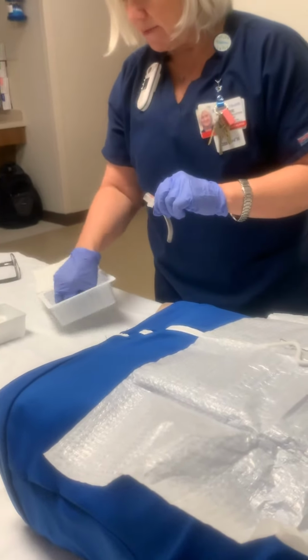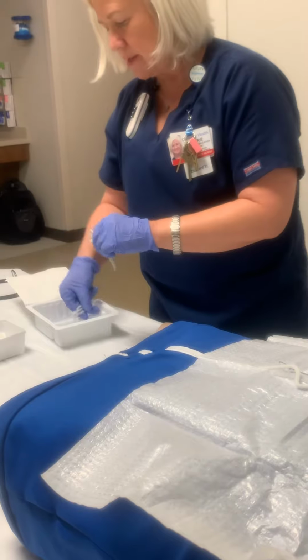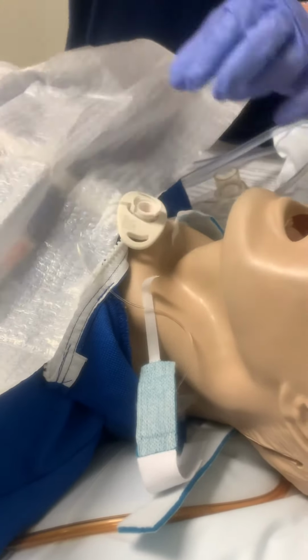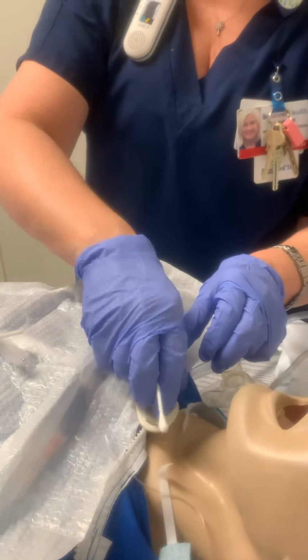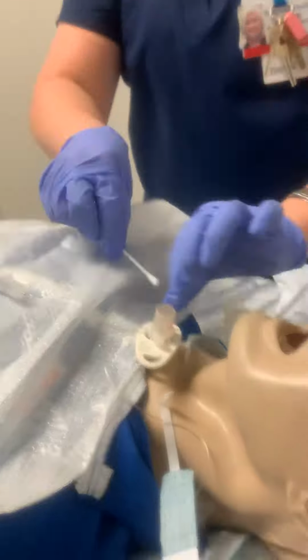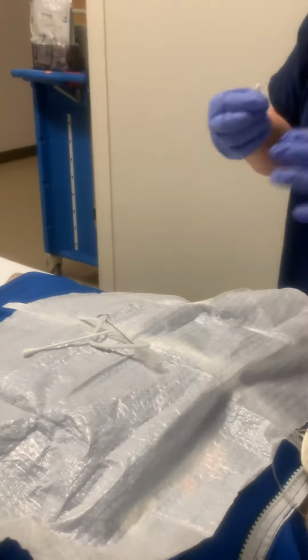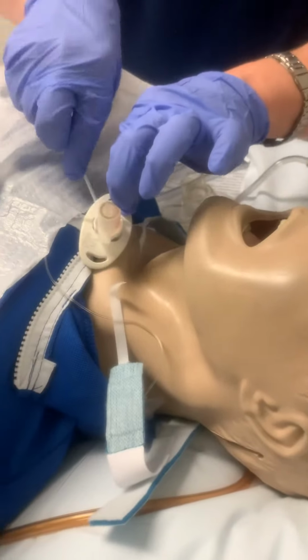You also have the little cotton applicators that you can use to clean underneath your trach. But I usually like to get my inner cannula back in first. A lot of times it's a little bit easier: you put it toward the head and give it a little twist around. You want to clean those crusts, like I said, underneath there. Clean all the crusts that happen to be around your trach. Discard this one, and don't keep reusing. If you think you need more, get more sterile applicators and clean underneath here.